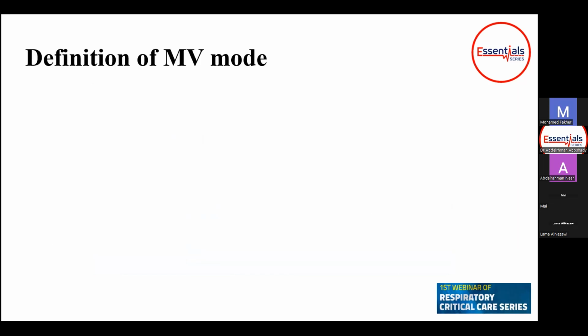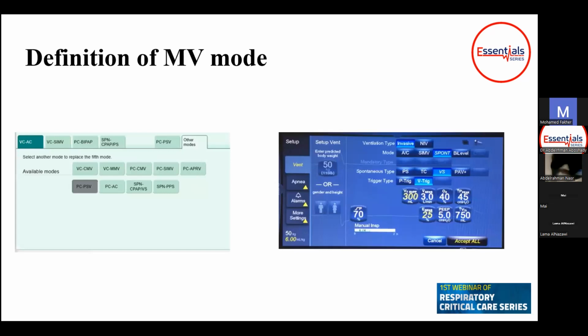Okay. So let's start. What is the definition of a mechanical ventilation mode? What is a mode of mechanical ventilation? We have many modes that we can select from. Hundreds of modes, as we said, 170, I think. If we merge the ones that mimic each other, we have something like 80 or 90 mechanical ventilation modes.